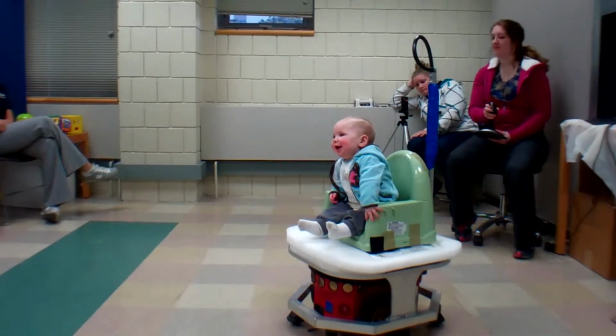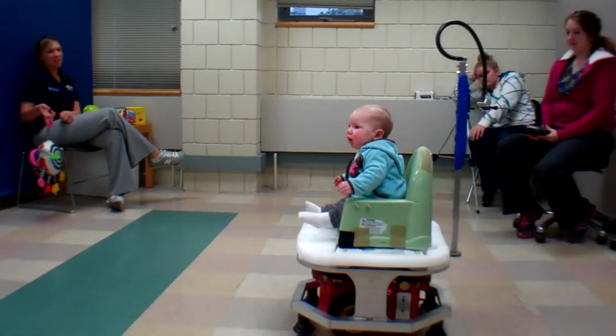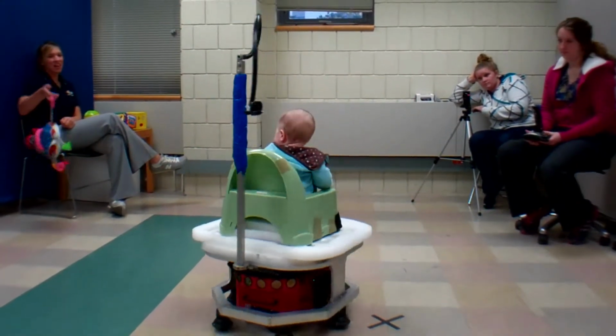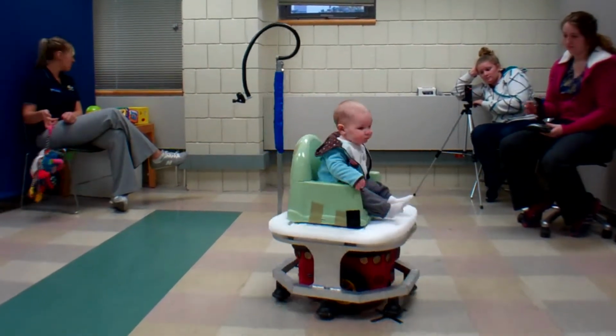When we set up the joystick and put it together with the software that controlled the robot moving, there were lots of little things that had to be worked out, because initially if you just moved it a bit, the whole robot just turned really quickly, which would cause a startle reaction for babies and we would lose them, so we couldn't have that. And so we had to control the speed and the speed of turning and all that kind of stuff and play with the thing.